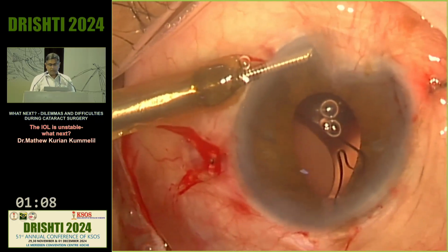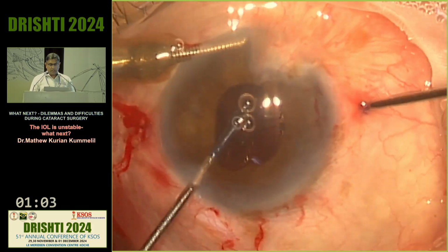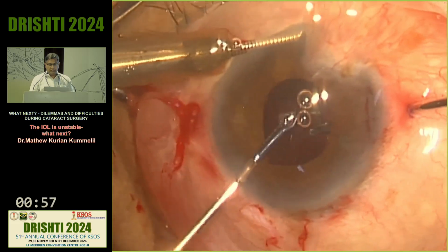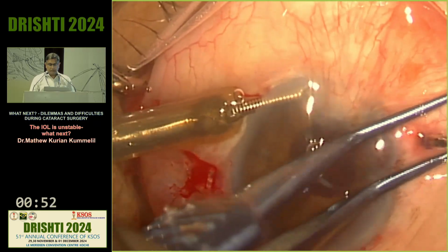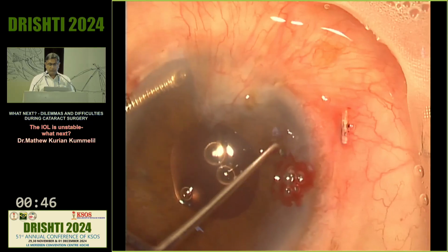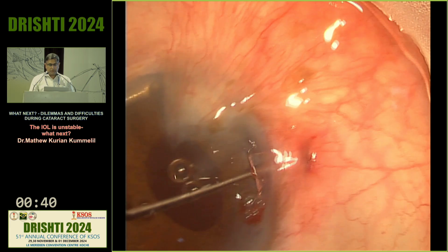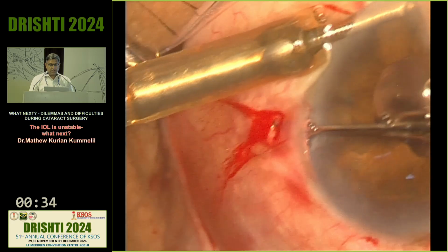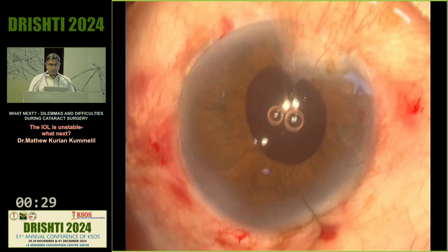The T-shaped haptic is exteriorized. For the second trailing haptic, I use a handshake technique, hold it close to the T and exteriorize, and use some counter pressure to exteriorize and get the T out. And once you have the T out, go through the pocket with the Sinskey hook and gradually draw the T portion into the pocket, so that externally it looks very clean and the T itself closes the hole.